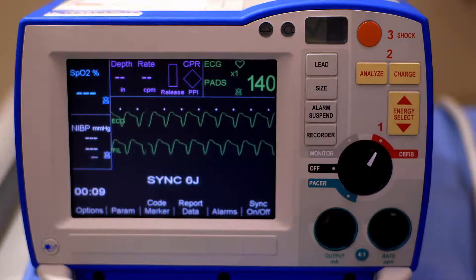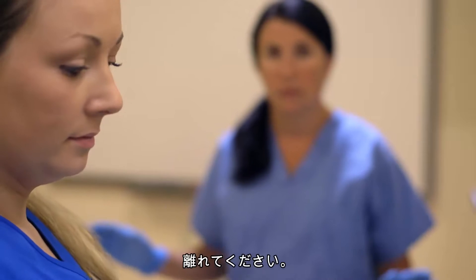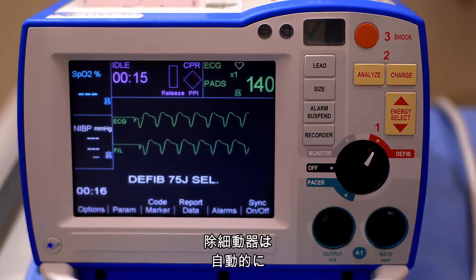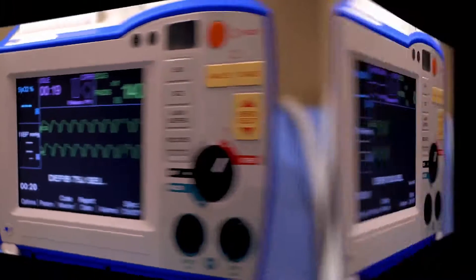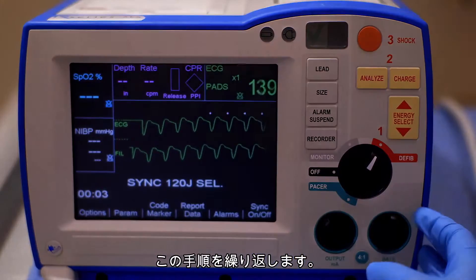Then press CHARGE. Before shocking the patient, ensure the environment is safe for defibrillation. Clear? Press and hold the illuminated shock button until the discharge occurs. The defibrillator will automatically revert back to defibrillation mode. Repeat this process starting with pressing the SYNC softkey if necessary.